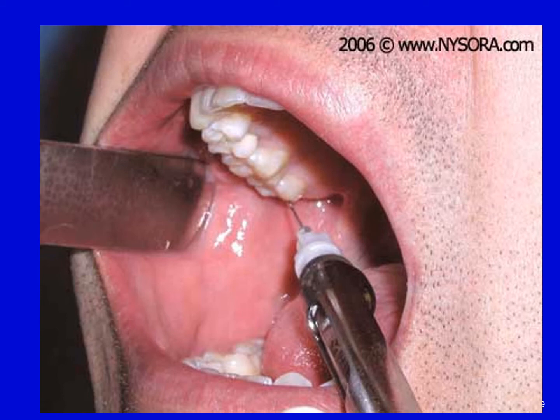On this particular injection, like the IA, the patient has to open as wide as they can. On this Gow-Gates, it's super important that they do that, or the condyle is not going to be in the right position, so they have to have their mouth open really, really wide. So a contraindication of this particular injection would be people who can't open their mouth very wide, or they have trismus, or some kind of condition where they can't open their mouth wide. They would not be a good candidate for the Gow-Gates injection.